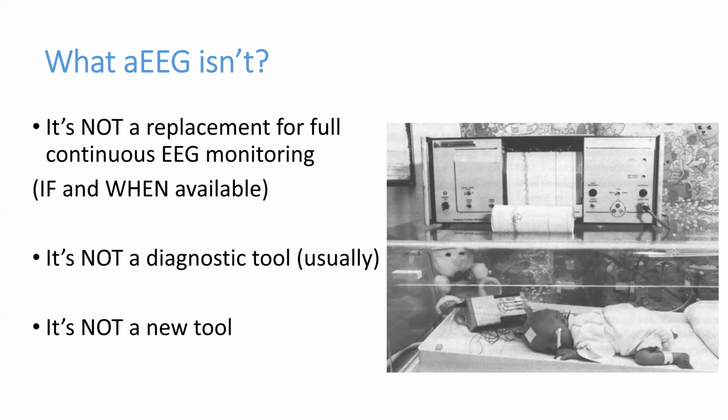And so this is just to show you what aEEG isn't. It's not a new tool. It's been around and being used in neonatal units since the 90s. It's not really a diagnostic tool, and I put in parentheses "usually," because there are some places that only have aEEG, so they want to be sure that they're using it fully. And it's definitely not a replacement for that full EEG, which I mentioned before.